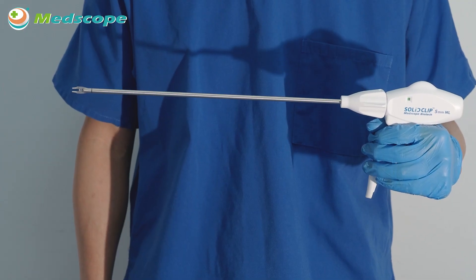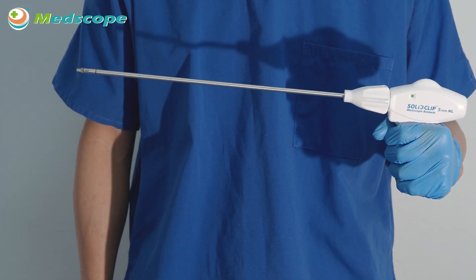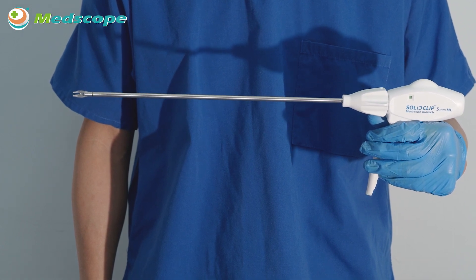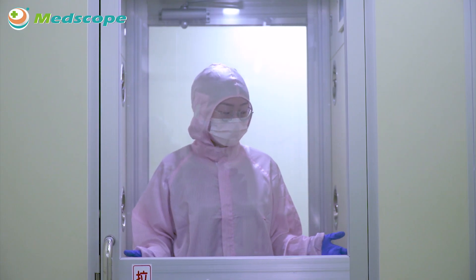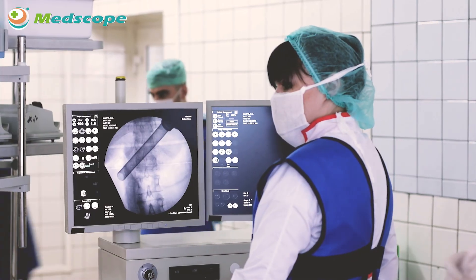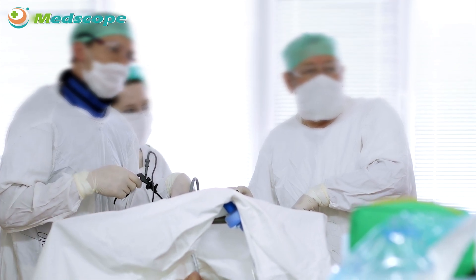Advantage 5: Stable ligating experience during the operation — no shaking or other unstable situation when ligating during operation. Advantage 6: Reliable closure and secure retention. Inner cross clip design provides superior on-vessel clip retention and improved hemostasis. MedScope's solid clip single-use applier is safe, precise, and user-friendly, which could assist surgeons to accomplish precise minimally invasive surgery.